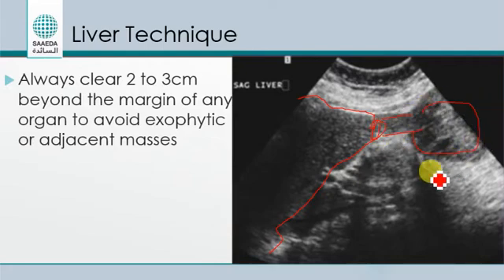There is some exophytic lesion, maybe 5-6 centimeter, hanging from the liver, and it appears connected to the liver, okay? This was a hepatocellular carcinoma, a hepatoma, okay? And it was an exophytic tumor, just hanging from the edge of the liver.